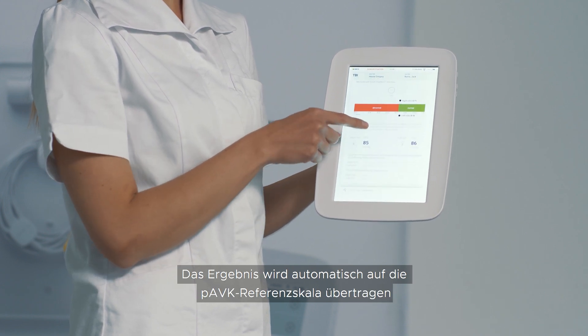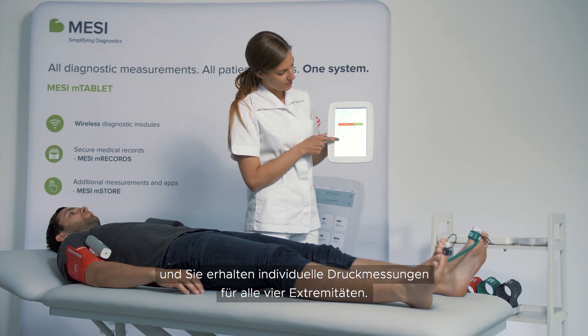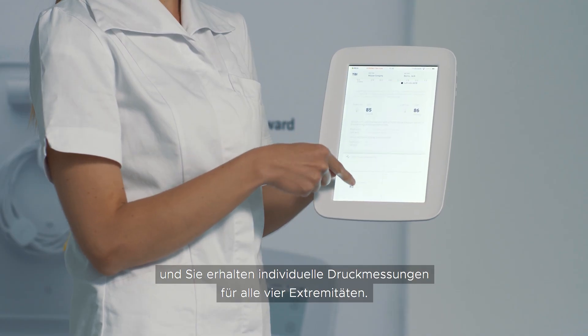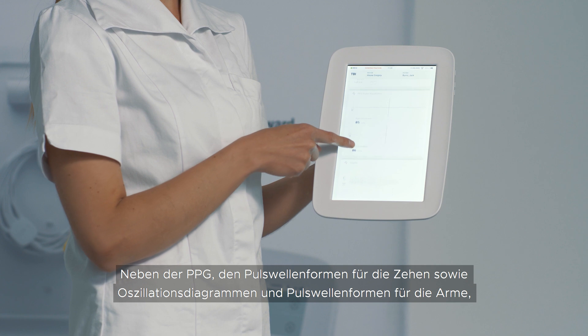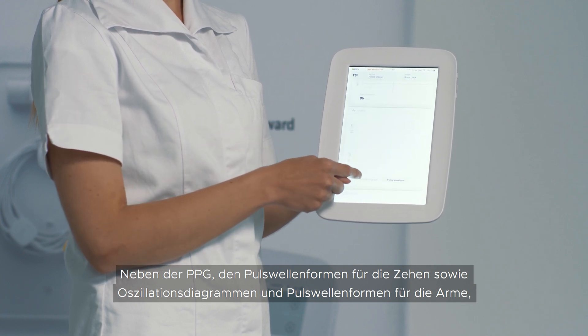The result is automatically put onto the PAD reference scale and you receive the pressures in all four extremities along with PPG pulse waveforms for the toes and oscillation graphs and pulse waveforms for the arms.